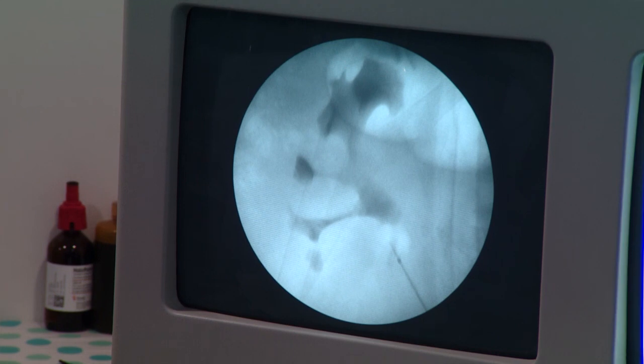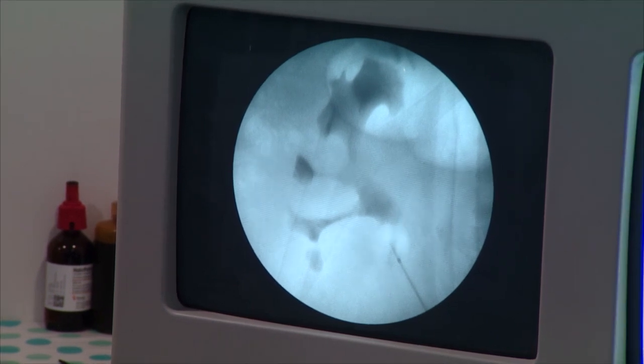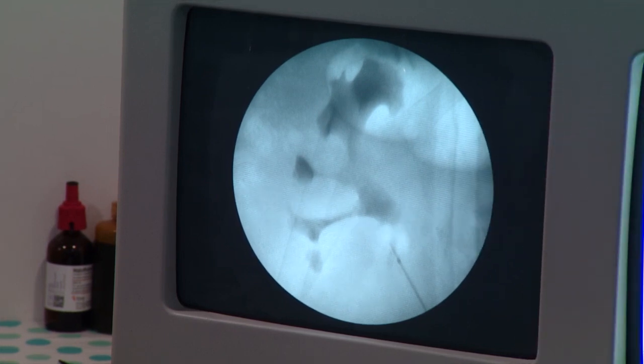Yes, do we need the Terumo? Yes. We have a special guide wire for this purpose. No, we take a hydrophilic guide wire now. It's better. Yeah. Just a moment.